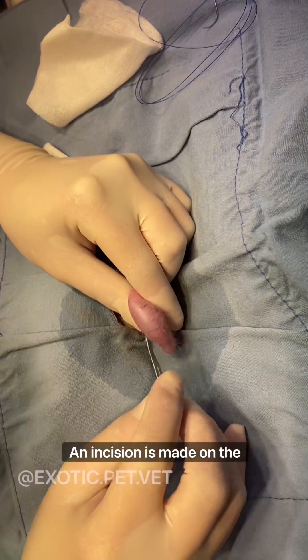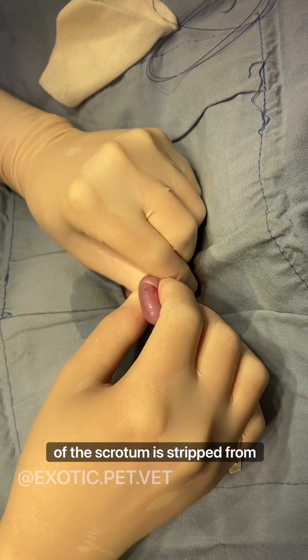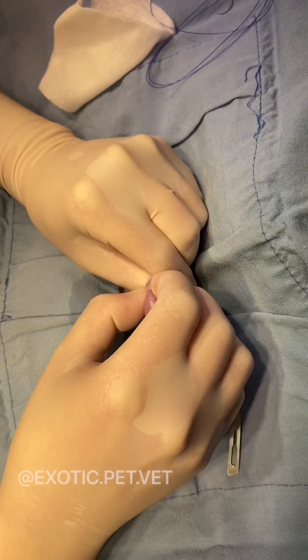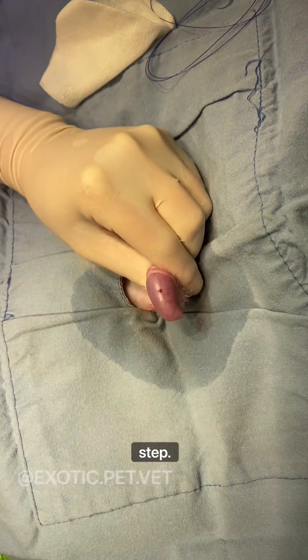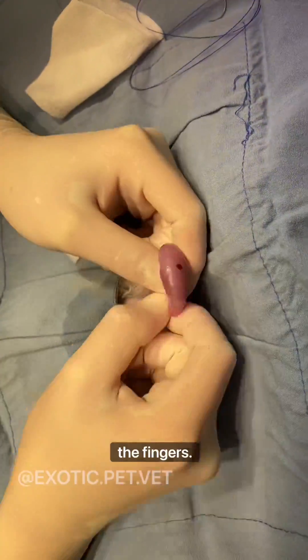An incision is made on the ventral aspect of each scrotum. The internal surface of the skin of the scrotum is stripped from the vaginal tunic. Gauze may be used to help with this step. The ligament of the tail of the epididymis should also be torn either with scissors or using fingers.